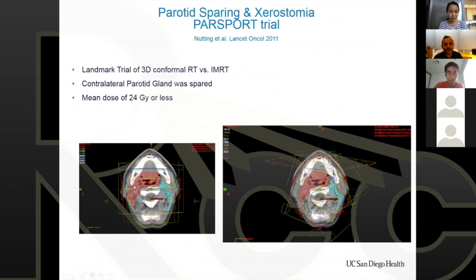And you can see that we never really contoured anything. I basically drew this on a port film. And you treated everything. You clearly treated your cancer, but your salivary gland saw the same full dose of radiation that your tumors were seeing up in this location. And here you can see this is an old-fashioned plan.